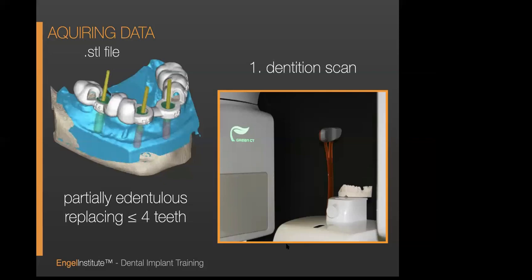All right, so now you have choices. If you do not have a CBCT machine, then what you can simply do is take those two really nice PVS impressions, put them in a bag, and send them overnight, or 2-day them in this case, to 3D Diagnostics. They will take over. So basically, all you'll need is a CBCT and 2 really nice impressions. You can send one. I recommend 2, because if there is a bubble in one and there's a problem with accuracy, they have a second chance.